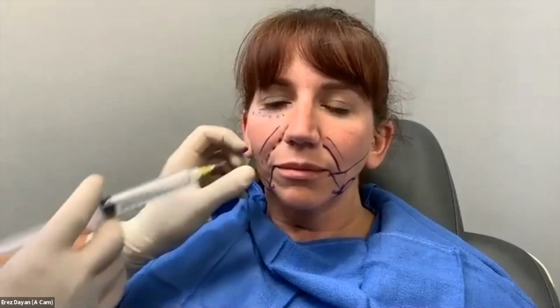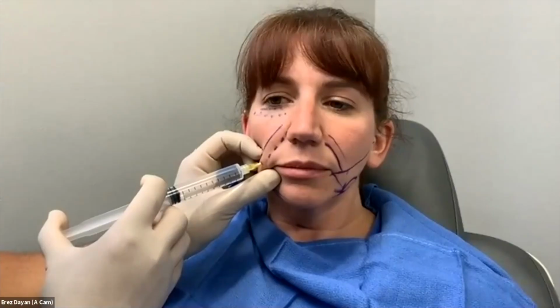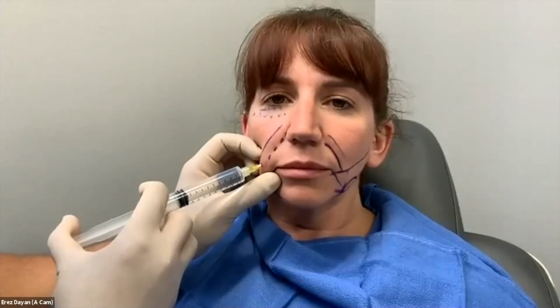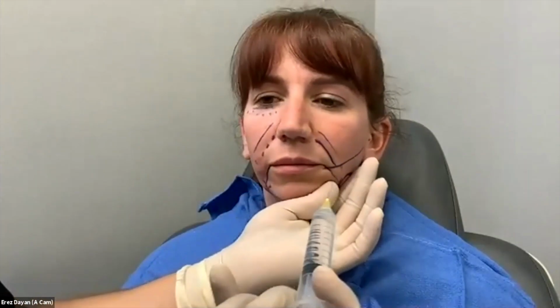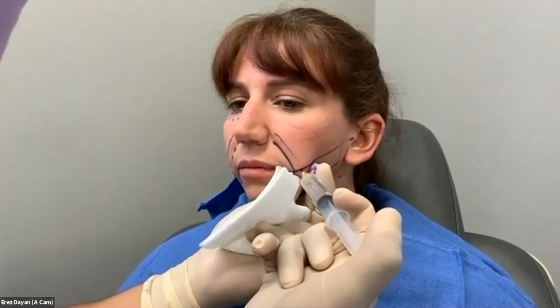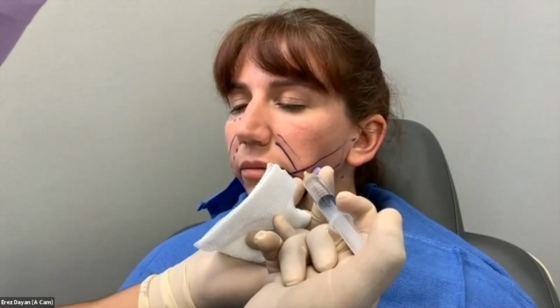So it's pretty much the same technique here. I'm going to just come in just here, pinch, go straight deep in and just slowly make a little wheel. Okay. And then, yeah, thank you. So usually I just do a couple cc's. So a 10 cc syringe is good enough for me just to get in at all these areas together.